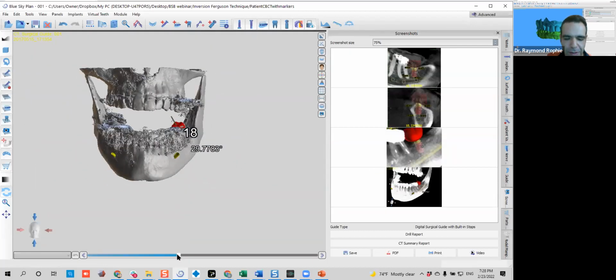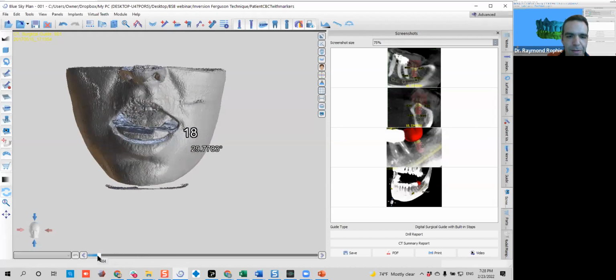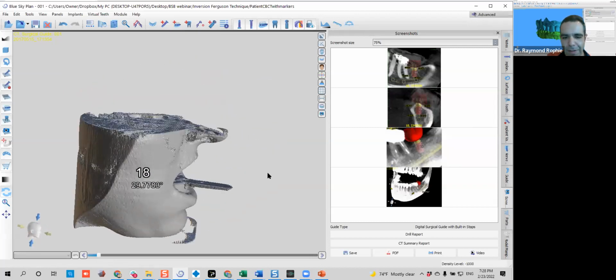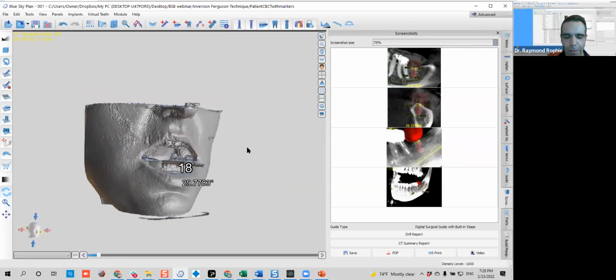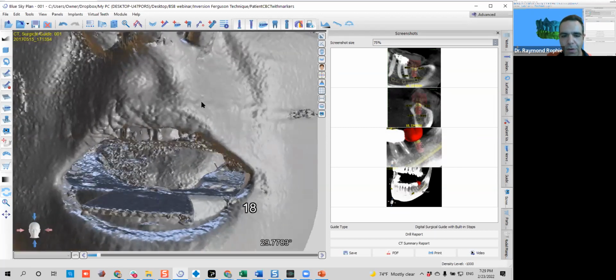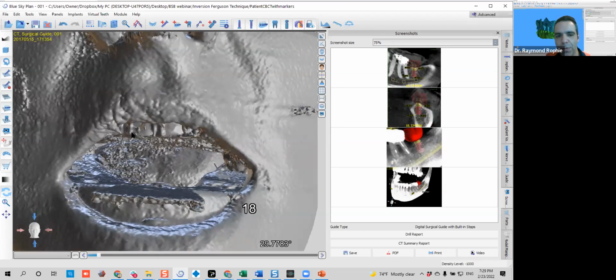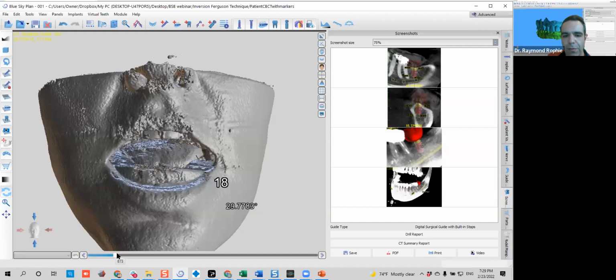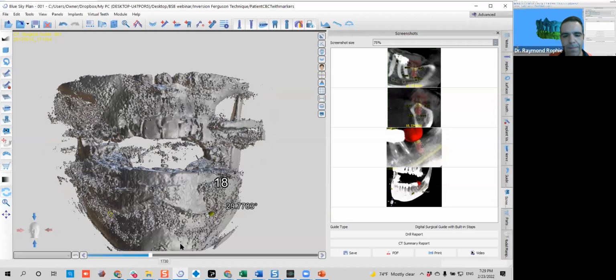I mean, I don't know what the aspect of this patient is at this point in time, but there are many cases where the patient is not having the mouth as open as this one. But if we're working on anterior teeth, you can even overlap the anterior teeth this way. It's not a face scan, but it's pretty close. And the anterior cases that I do using this technique so far have been giving great results using this, okay?